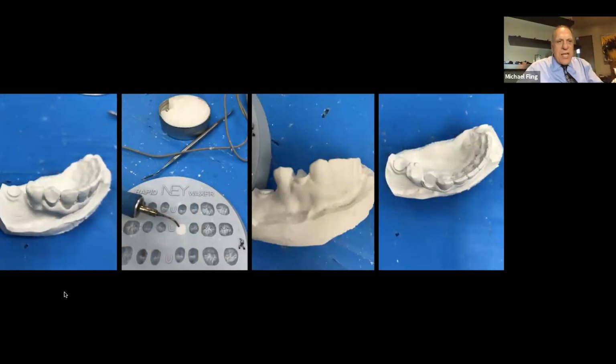So take a look at this case here. What I've got here is somebody comes in and they've broken a tooth. So I've already had these teeth pre-made.